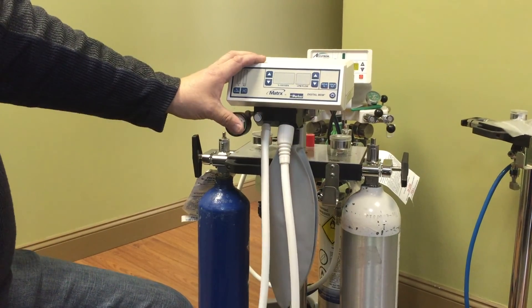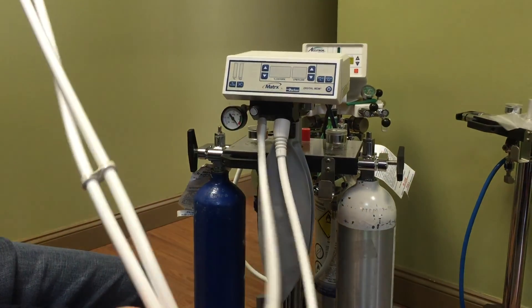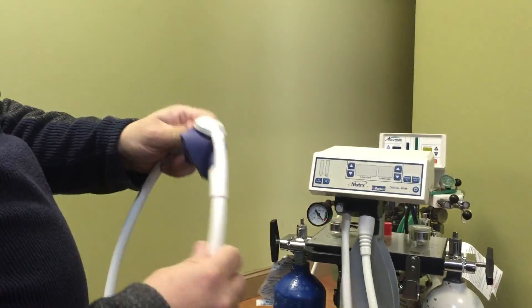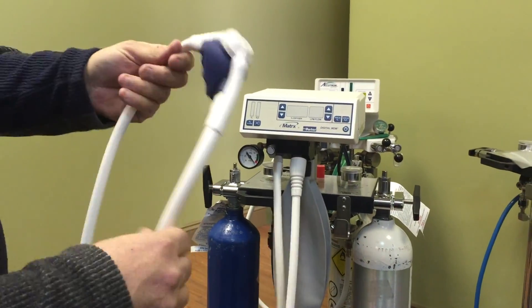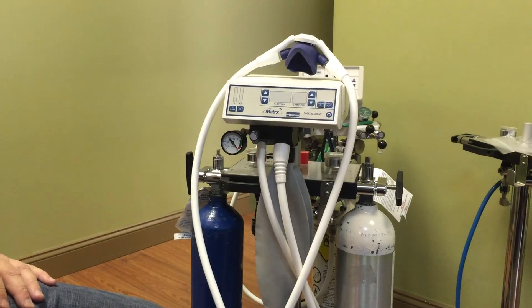This is going to be a how-to on how a digital MDM works. Make sure your scavenger is all hooked up and you've got a sterile nasal hood on there. We're ready to go. You want to prep your machine before your patient comes into the room.